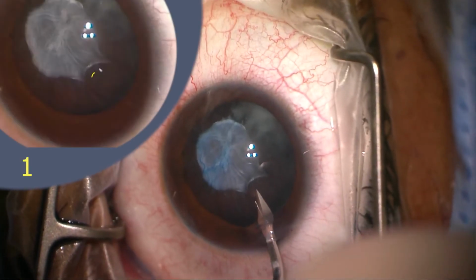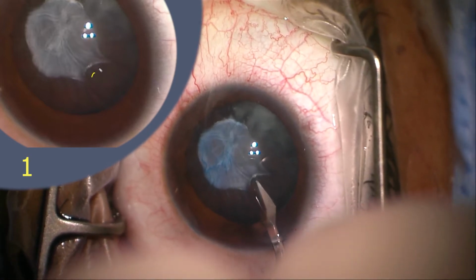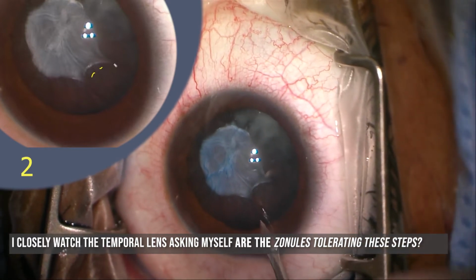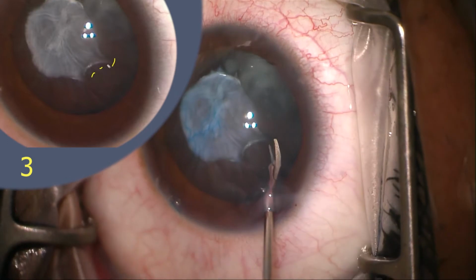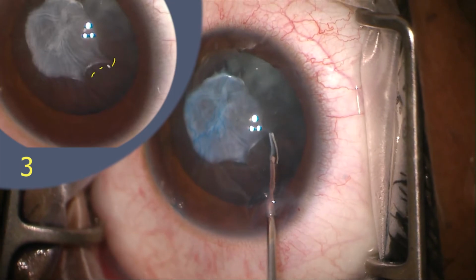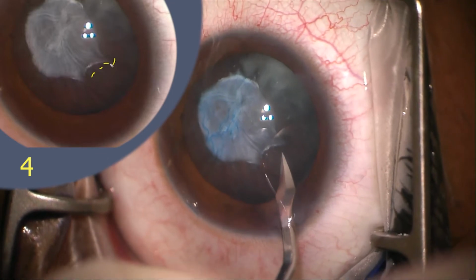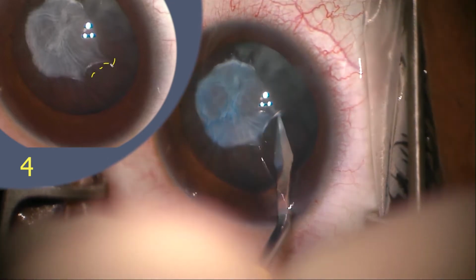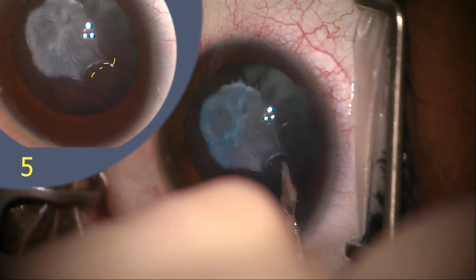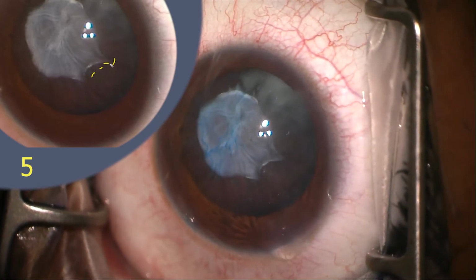So again, I don't know where I'm going to be able to affect the capsulotomy, so I'm going to try it first through the capsule, and that's at sort of position 1. I'm watching carefully to make sure I'm not putting too much tension on the zonules, but those two positions don't puncture. Then I'm hoping one of these ridges in the capsule can be clipped. That's why I got this scissors out, but it didn't work either. My third thought had been whether there was a brittleness or an ease of opening between the capsular plaque, which is dense, and the less dense native capsular tissue, but it doesn't work there.